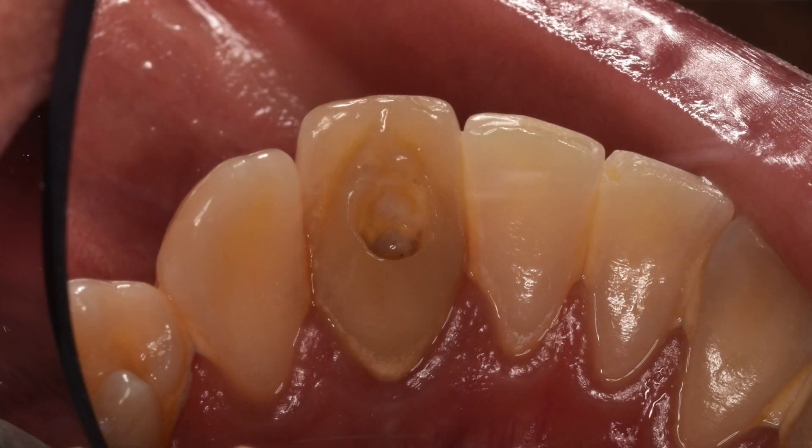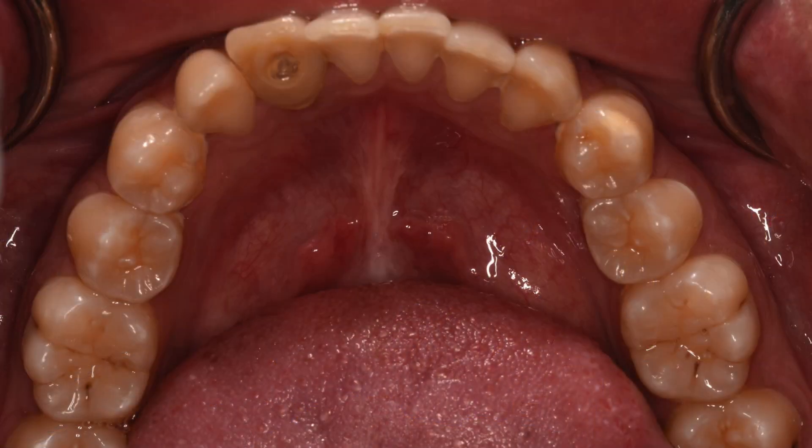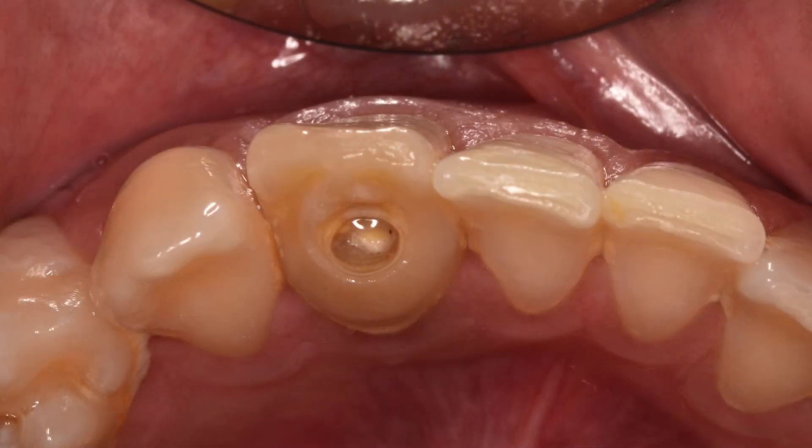What we decided to do was intentional replantation, which is where you remove the tooth, prepare it surgically in the hand, dry out all the internal space as much as you can, and then retrofill it with MTA — mineral trioxide aggregate — then put it back in and splint it. These things are actually fairly successful, somewhere between 80-90% according to who you read. When it tightens up, we plan on going through the coronal portion, removing as much as we can with a large round burr and a crown prep burr, and then placing a couple of fiber posts through the top.